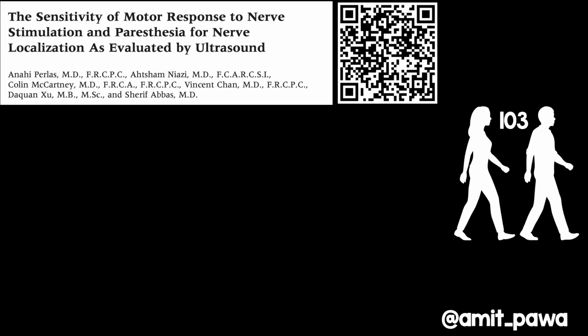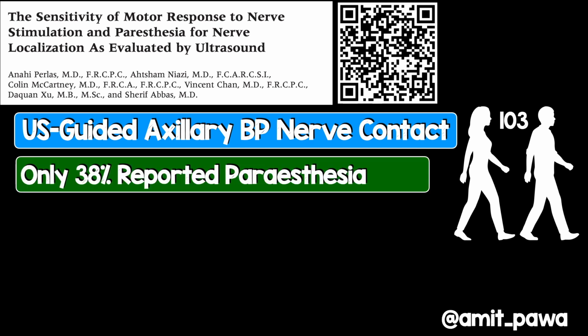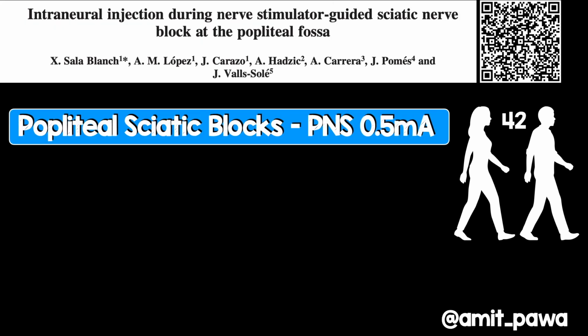This is definitely making me wonder what on earth is going on here, but I know what you're saying. Paresthesia is old school. So in this study, in 103 humans, they did an ultrasound-guided axillary brachial plexus block, but they aimed to get the needle in contact with the nerves. And what they found fascinating was that only 38% of patients reported paresthesia. And when they had that needle contact, in 25% of cases, they required currents of up to 1 milliamp. So what have we learnt here? Nerve contact does not always generate paresthesia, and in cases when you do have nerve contact, you may get no twitch at all at 0.5 milliamps. This is worrying.